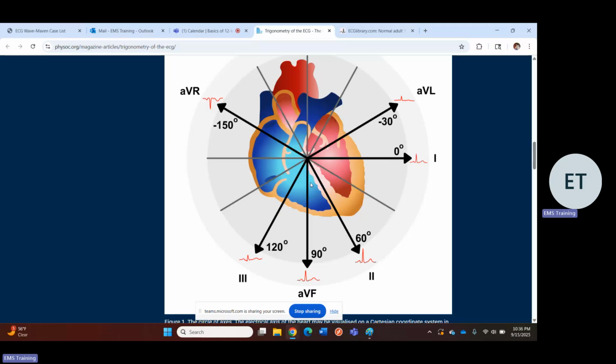How can you identify trends if you induce changes by moving the leads, placing them wrong, or moving the patient up and down? You can't identify trends. You are externally inputting changes to the EKG, and then you're trying to identify, is your EKG changing, i.e., are there dynamic EKG changes, i.e., is the patient's cardiac condition getting worse? You can't say with certainty that it is or isn't if you're moving the leads, if the leads are wrong, or if you're changing the patient's position.